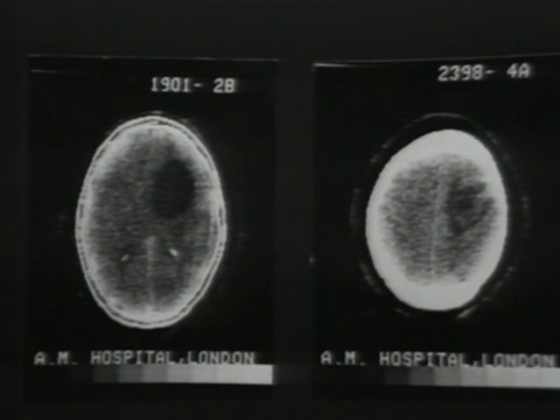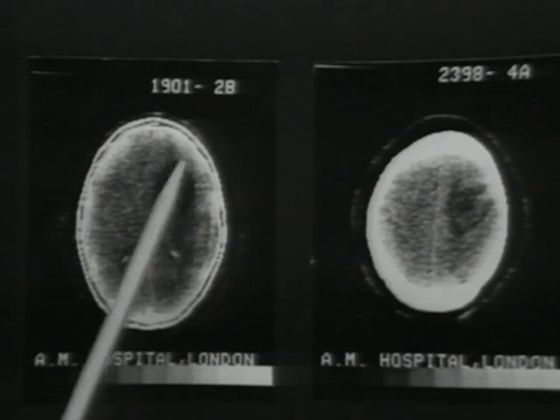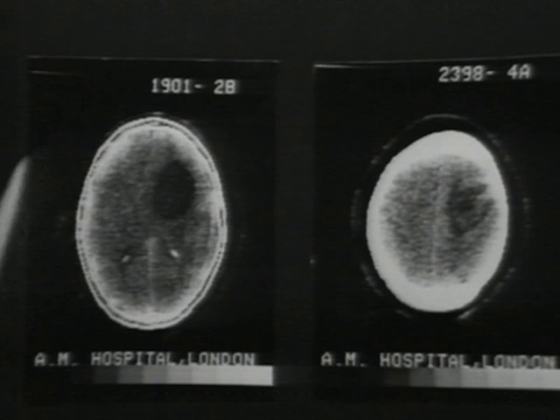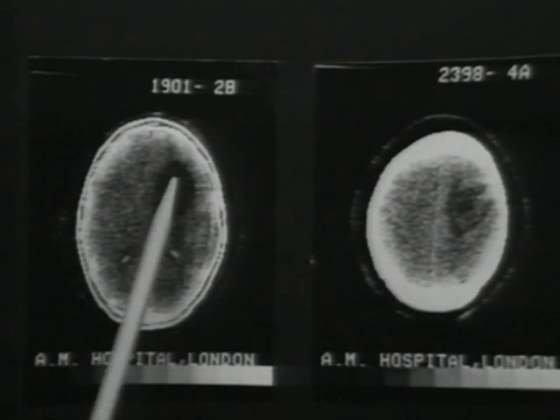Low absorption values occur in many different disease processes, including neoplasms, infections, infarctions, or indeed any process where there is a breakdown of normal cell structure and/or an increase in water content. For example, coagulative necrosis, microscopic and macroscopic cyst formation, or gross demyelinating processes. Now, in the scan, we can see a well-defined area of low density. This is obviously a cyst filled with fluid, and it's associated with a malignant tumor.